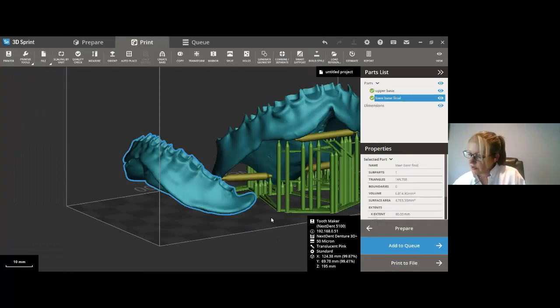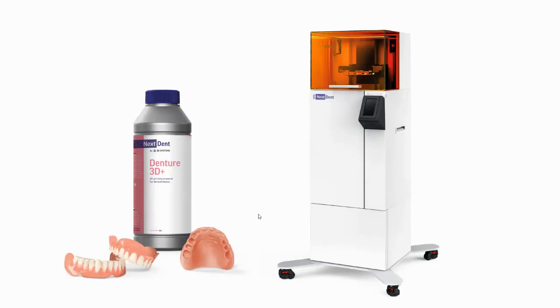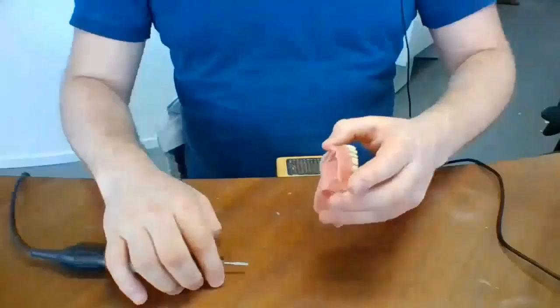Okay, perfect. So now I'm not going to show you, oh well, Stein, do you have the slide about finishing off these bars by any chance? So earlier today, we did another webinar, where we also had Lars at NextDent doing live finishing of these dentures. So I have a short clip from that.